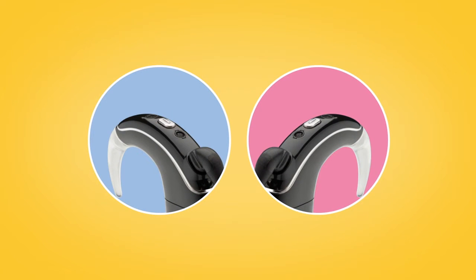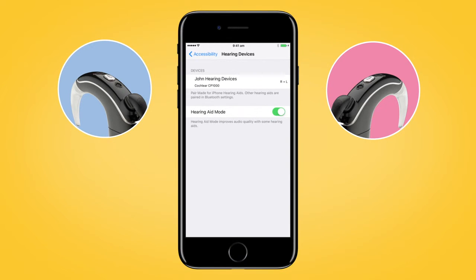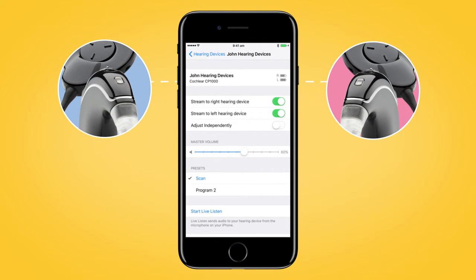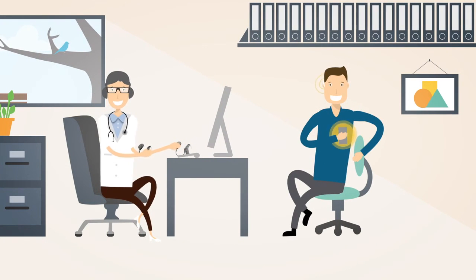If you have two sound processors, both need to be paired during the same pairing window. To do this, turn each of your sound processors off and back on again. Your compatible Apple device will search for your sound processors and display them as a pair in the Devices section. Select the name of your processor and tap Pair for each side to begin pairing both your Nucleus 7 sound processors with your compatible Apple device. Make sure to confirm pairing is finished as previously described for each processor. If you see your sound processors listed as two separate devices in the Devices section, see your clinician to have them configured as a pair.